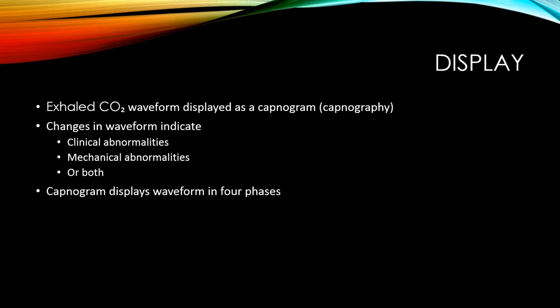If you hear capnometry, this is a measurement and a display of the end tidal CO2 value, but there is no waveform. So if you look back on that second slide with the Alaris pump, if you don't see a waveform on there, capnometry is what's measuring it. If you see that colorimetric CO2 detector, where the gold is good, that is another capnometry type measurement device, because it does not show a waveform, it just gives a number or an indication if it is within the normal limits.